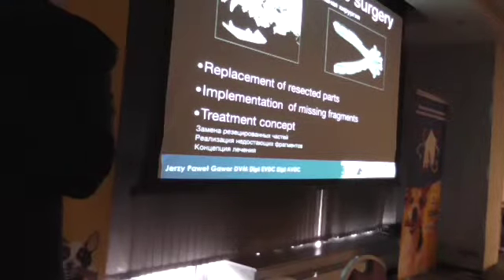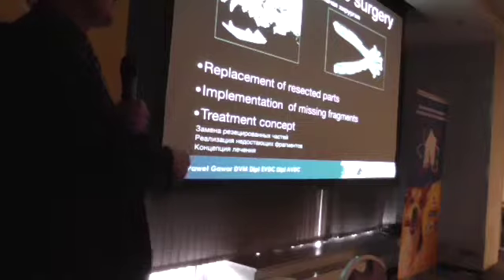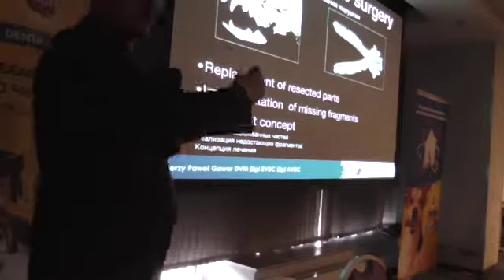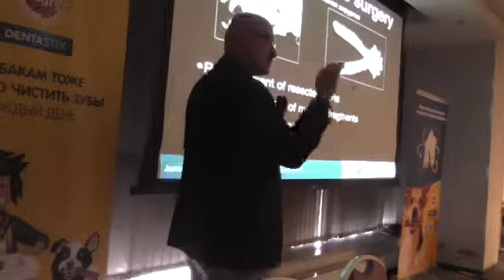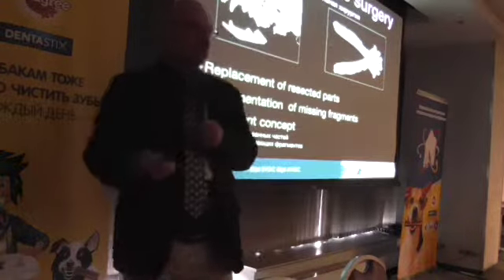And on the right side you see the rostral mandibular osteosarcoma at the very early stage of development. So we want to resect this part, and the owner wanted to implement the prosthetic supplement.